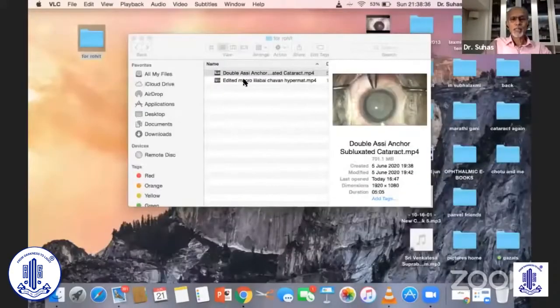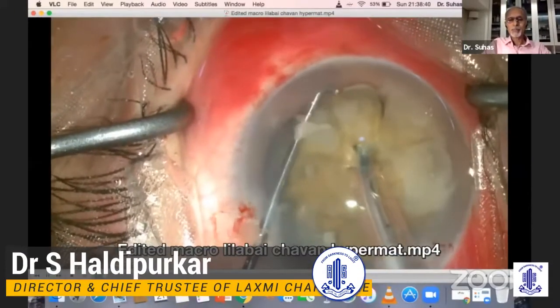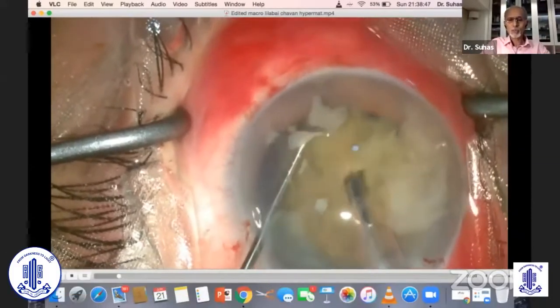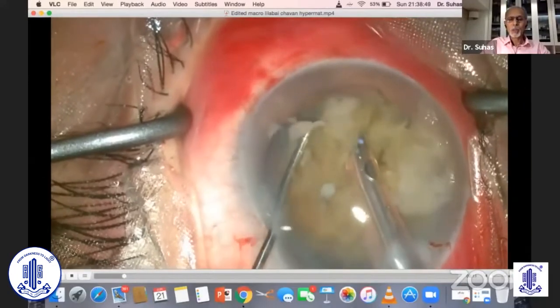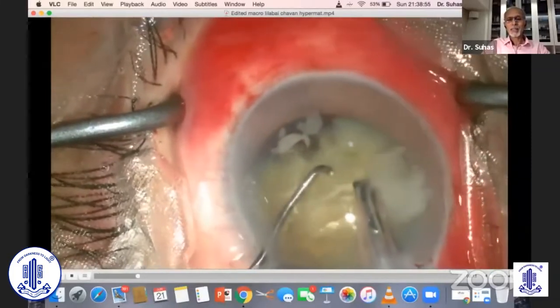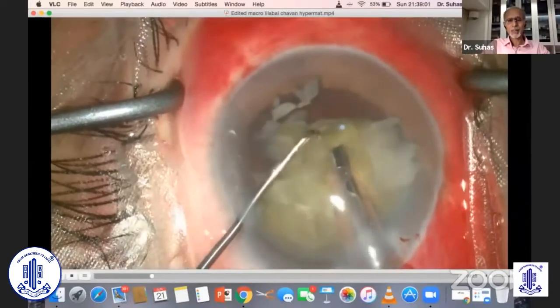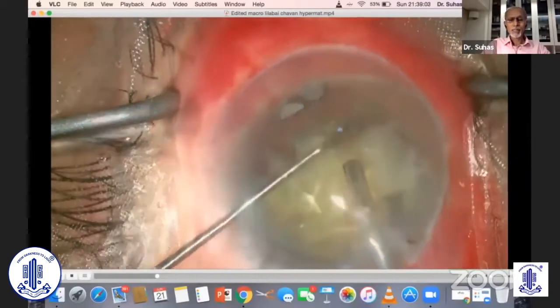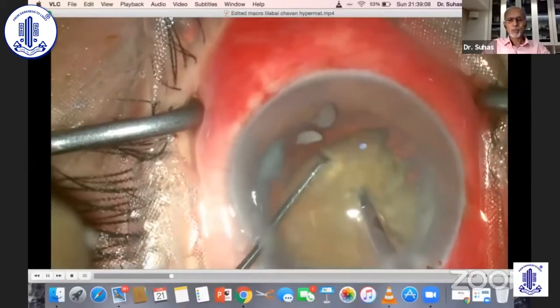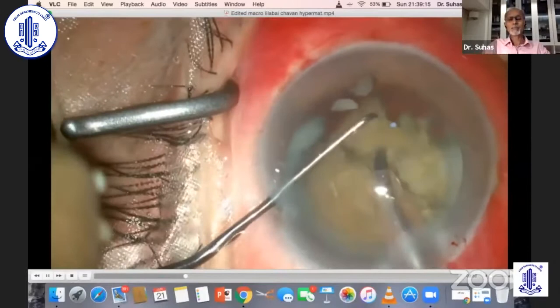The second case is a short but very interesting one. To begin with, there was a shallow anterior chamber with a lot of positive pressure, and the nucleus was quite hard. This patient was going for a toric lens, so I was very sure I didn't want to disturb the posterior capsule at any cost. After repeated changing of parameters, it was difficult to continue.